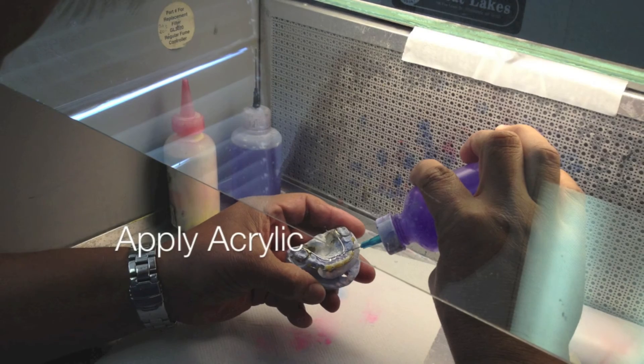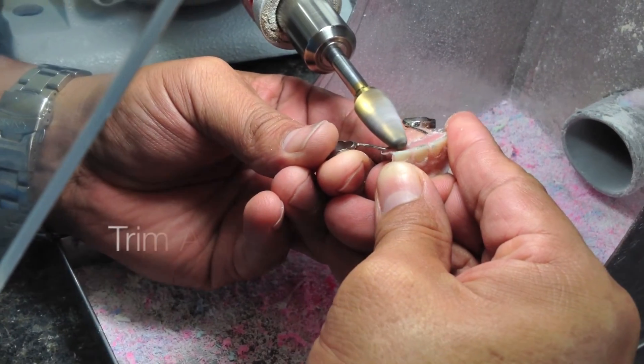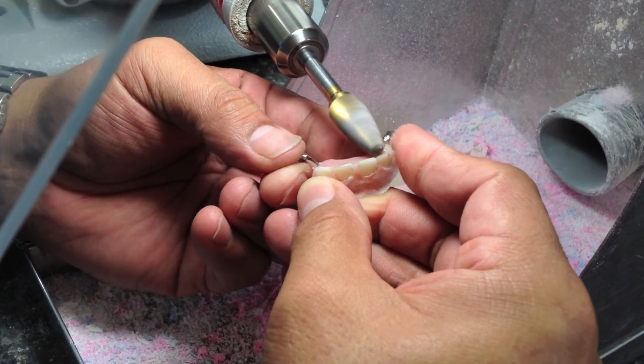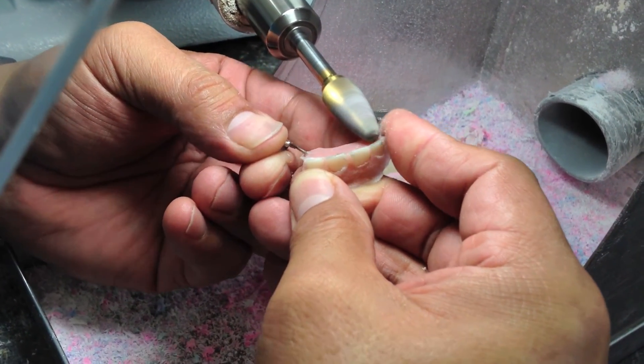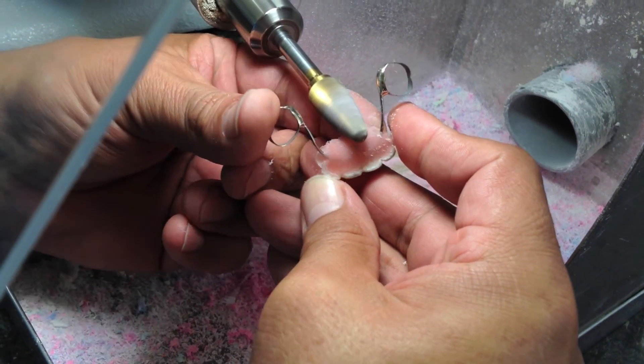Okay, ready for acrylic. Sorry I didn't get a video of the acrylic being poured, but it's pretty basic — just pour it up like you normally would, like a retainer. Just make sure you get acrylic up underneath the teeth, and make sure the acrylic is runny enough that you won't get any air bubbles.